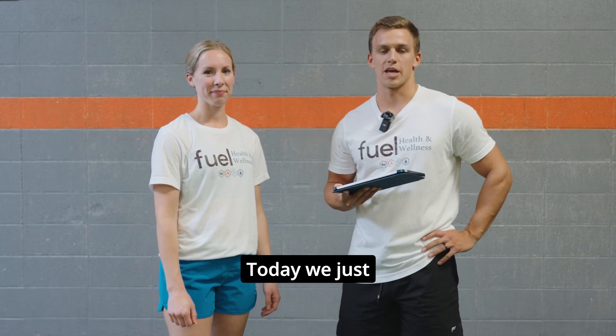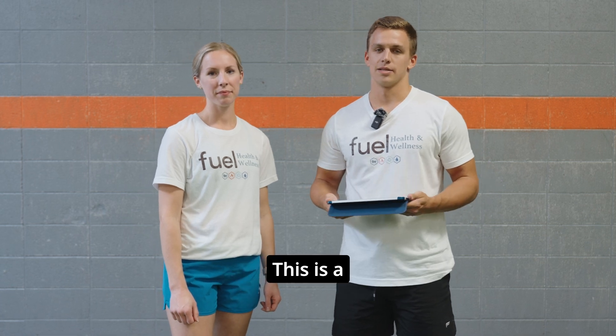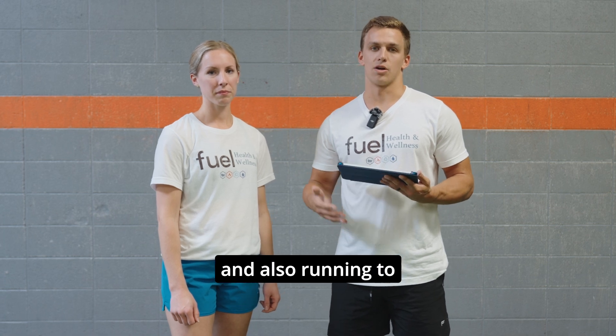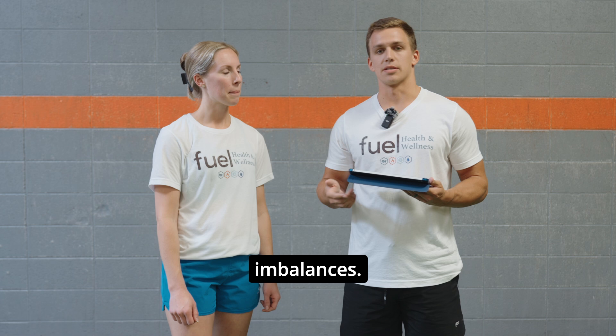Hi, I'm Alex. This is Haley. We're from Fuel Health and Wellness. Today we just wanted to share a little bit about our new technology called the Dorsa V. This is a sensory-based technology that helps us to be able to go through testing of the full body and also running to be able to detect things like muscular imbalances.